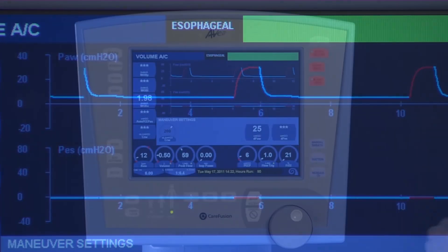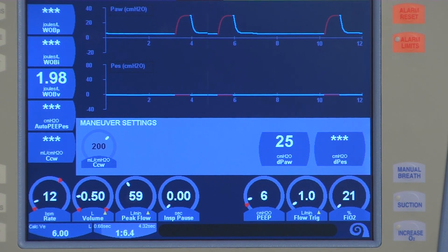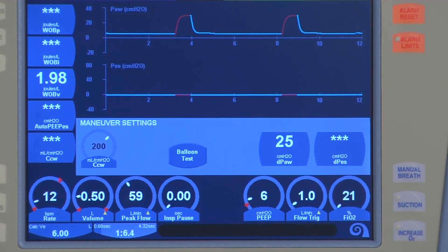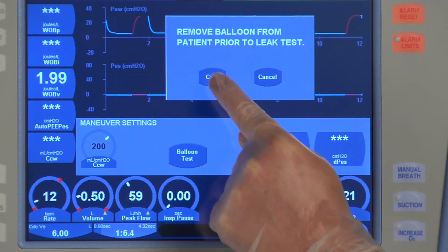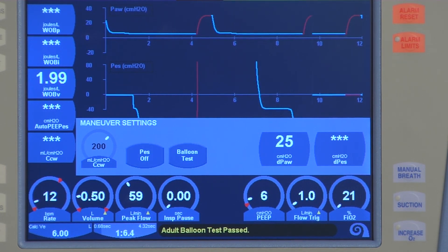You next select your balloon choice. Once your catheter is connected to the ventilator, the maneuvers screen will ask the operator to select the appropriate catheter. Once accepted, an icon stating Balloon Test will be displayed. The ventilator will then advise the operator to be sure the catheter is removed from the patient. Depress the button and allow 10 seconds for the balloon test to be conducted. Once the balloon test is completed, a message of Balloon Test Passed will be displayed on the bottom of the screen. The balloon is now ready for insertion.